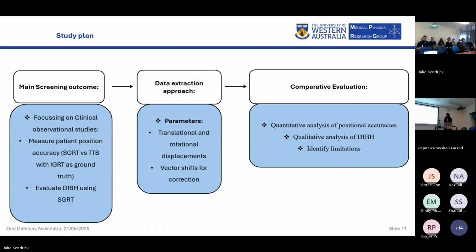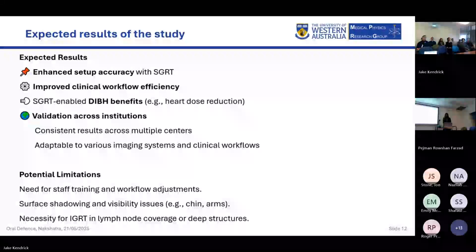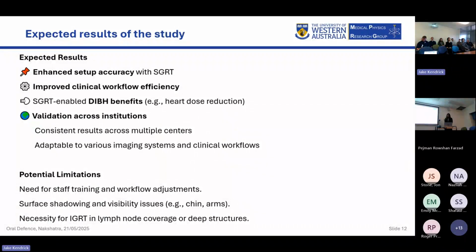The comparative evaluation will involve a quantitative analysis of the reported displacements across various patient setups, and also a qualitative analysis of DIBH, considering aspects such as patient comfortability, compliance, session-to-session reproducibility, etc., and identify the limitations.